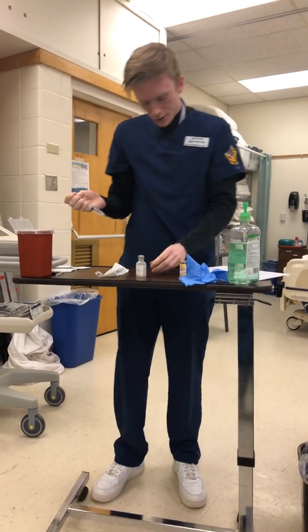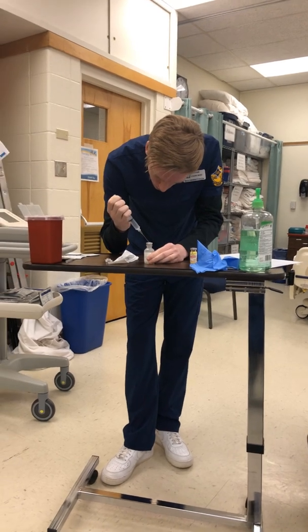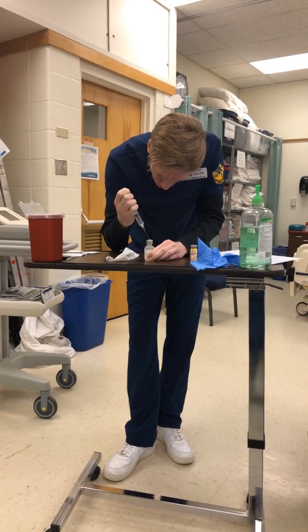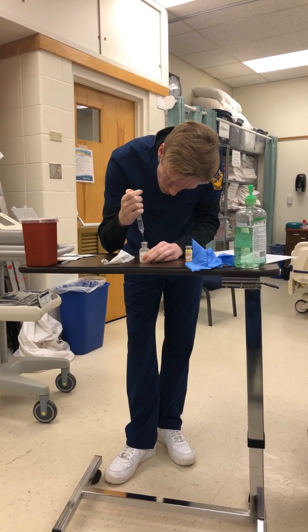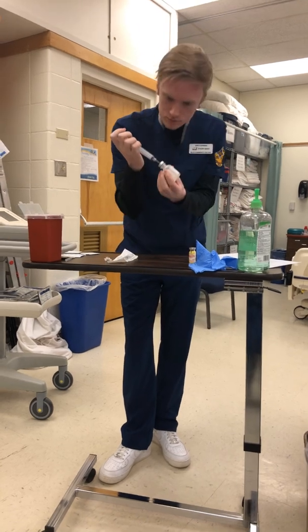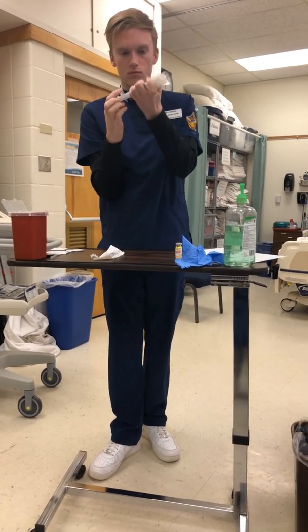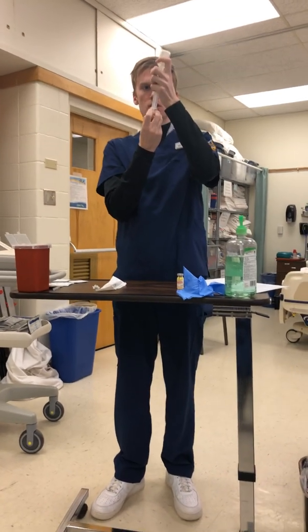Alright, and then shoot in the 5.6 mils of air into this one, and then withdraw 5.6 milliliters of diluent.